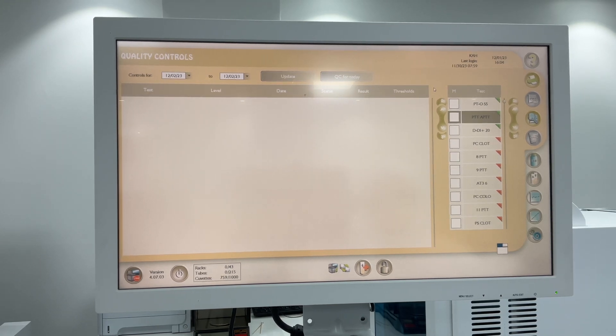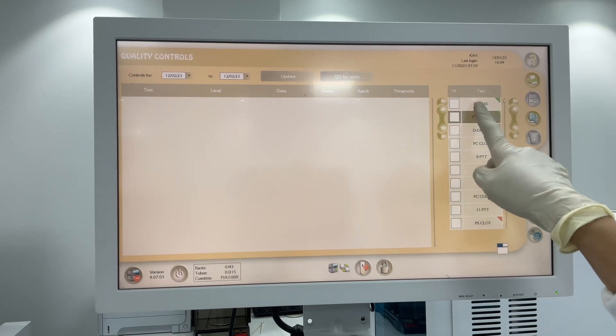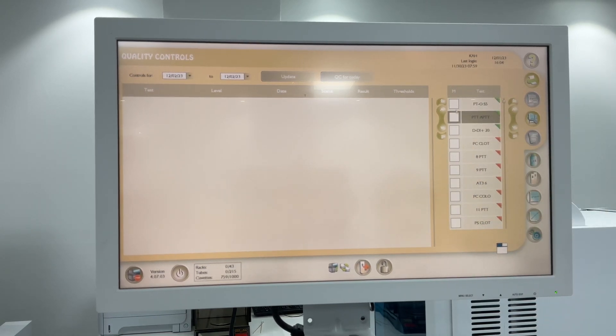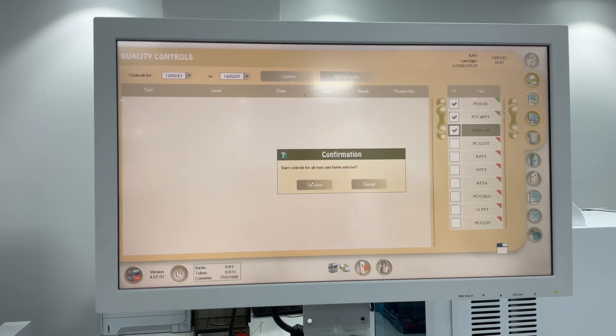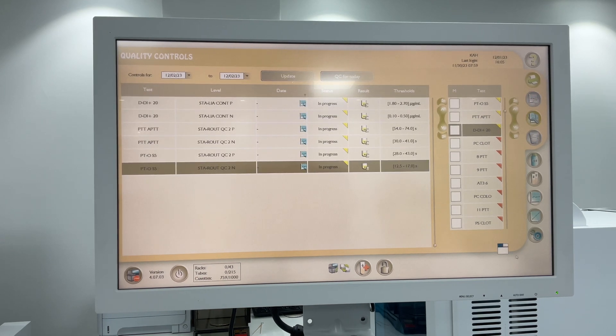If you want to run QC, you can see the reagents inside: PT, PTT, and D-dimer. Click items one and three and click Go, then Validate. This is your QC run.